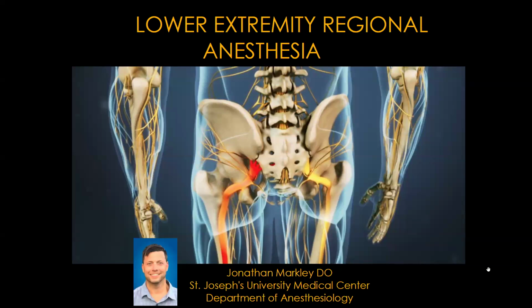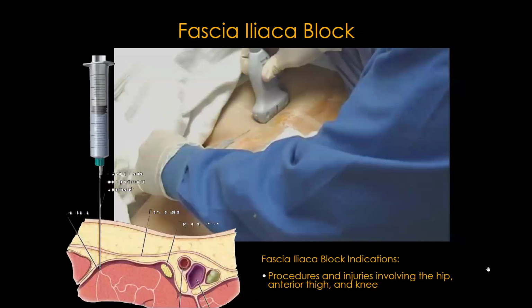Okay, good morning. I'm going to go over lower extremity regional anesthesia today. Jump right into it. So I'm going to start with the fascia iliaca block. With these blocks, you really just want to know the anatomy. That's 99% of it. So I'm really going to just focus in on where the needle might be and what the implications are.